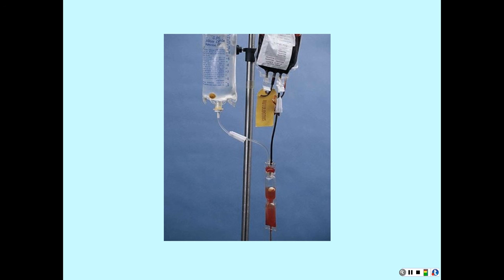Okay? Clamp it off. Go to your patient's room, hook this up to your patient, and just let it be going slow. Okay? I usually hook it up and put it at KVO. Okay? Just to keep the vein open. I've got my vital signs. My patient's consent is signed. Now I'm going to go and get my blood.